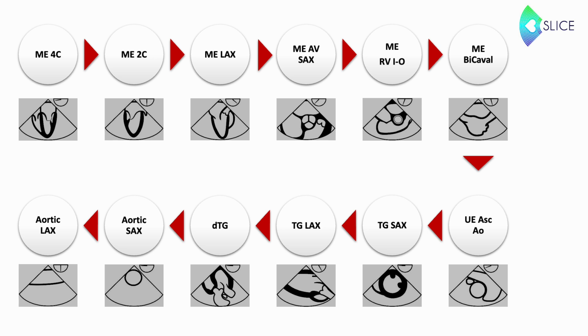These were the 12 focused windows that aid in cardiac and hemodynamic assessment. As you've seen, I've presented them in an order I find logical and practical, but the sequence can be individualized based on patients' needs and the investigator's preferences.